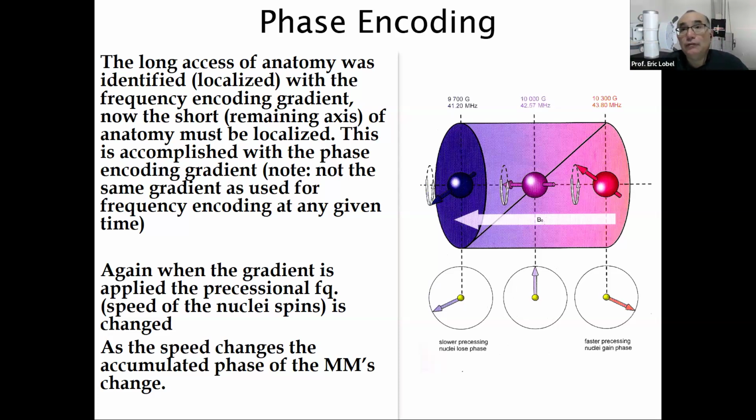And K-space is split into a positive top half, negative lower half. And each line has a number where the numbers are low in the center and get bigger if you go positive, but they also get bigger if you go negative. So +1, +2, +3, up to +64, -1, -2, -3, up to -64 for, let's say, a total of 128.